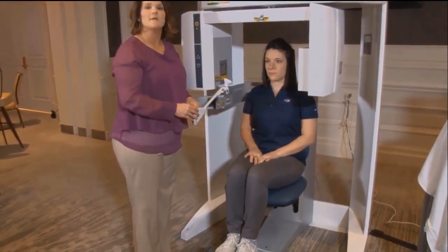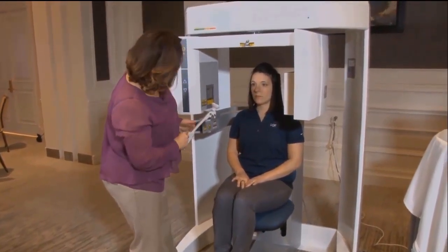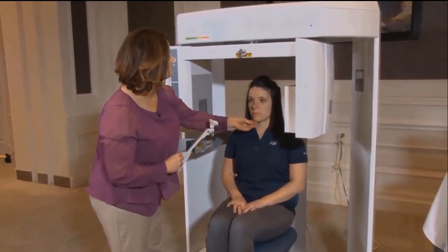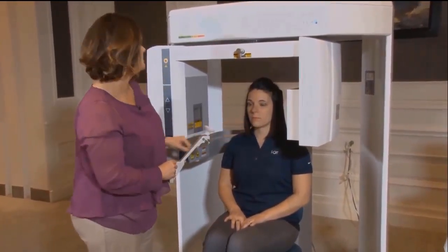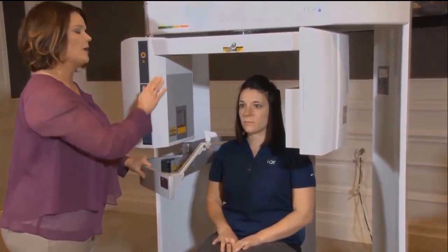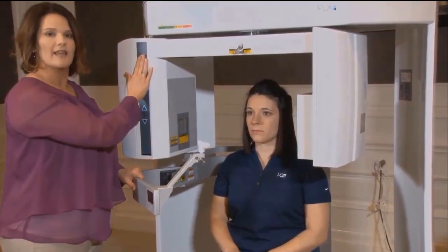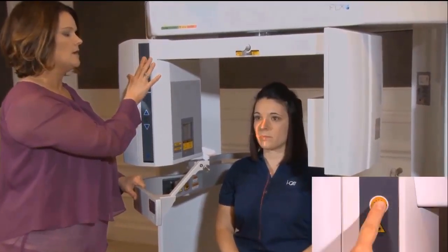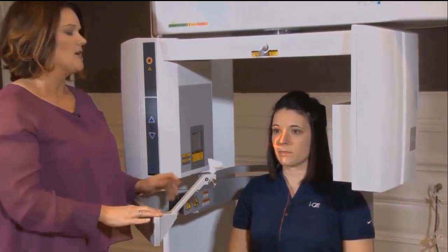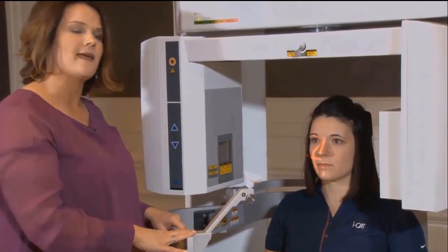The next thing I want to evaluate is the patient's occlusal plane — is their head level. I'm going to make eye contact with the patient and have her drop her chin down if needed, and bring it up just a little bit. The next thing we want to do is evaluate where our occlusal plane is before closing our gate. We're going to turn on our laser light. This occlusal plane line should be at about the tip of the upper first bicuspid.